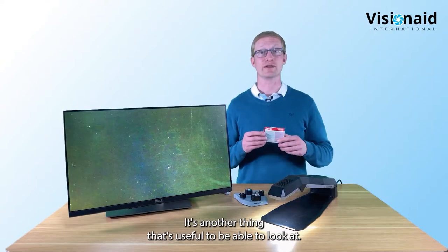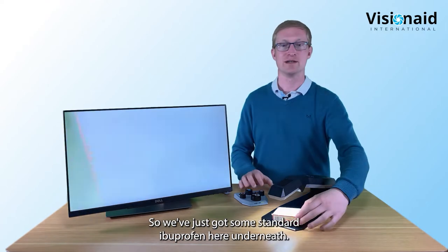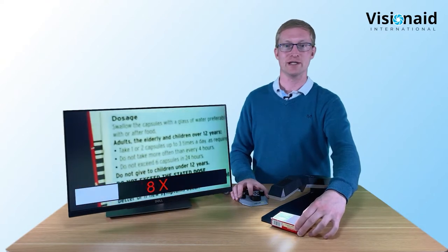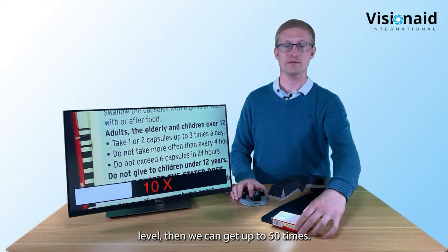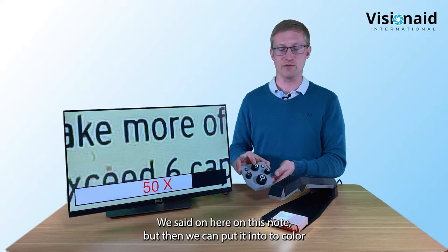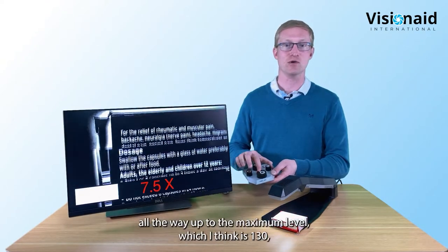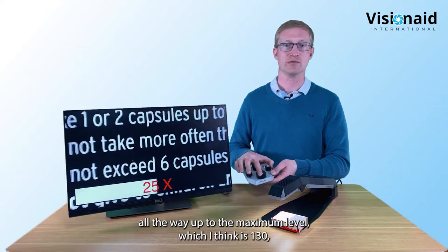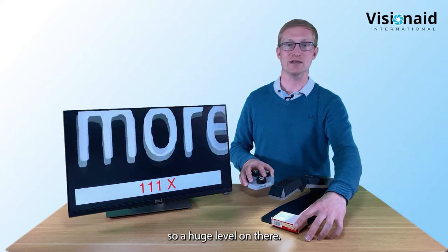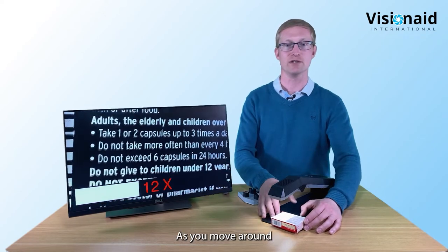Another useful thing is reading small print on medication packets. Pop standard ibuprofen underneath and zoom in. You can go up to 50 times in this mode, or switch to two-color and go all the way up to the maximum 135 times. The image is still really nice, crisp, and sharp even with really small text at maximum magnification.